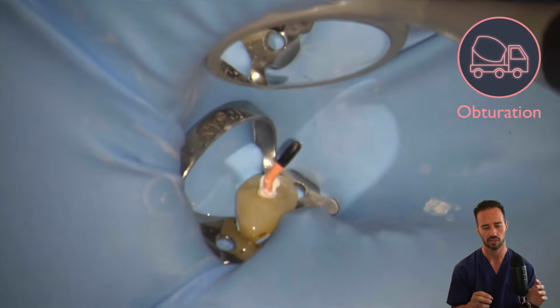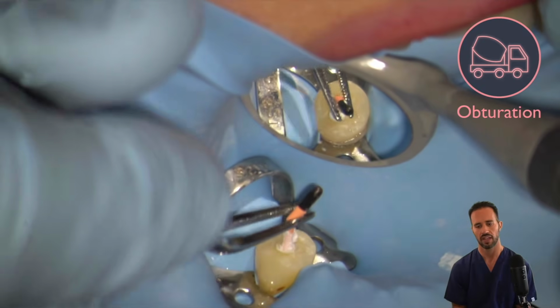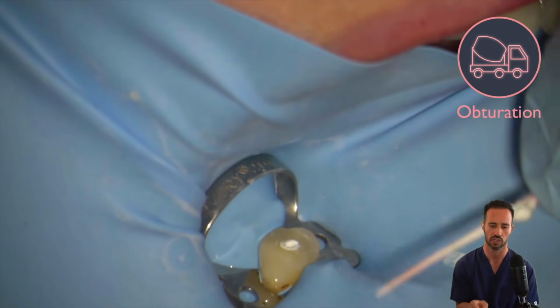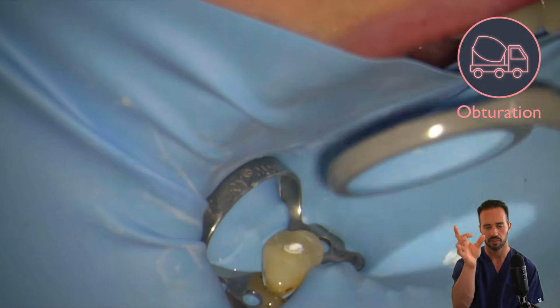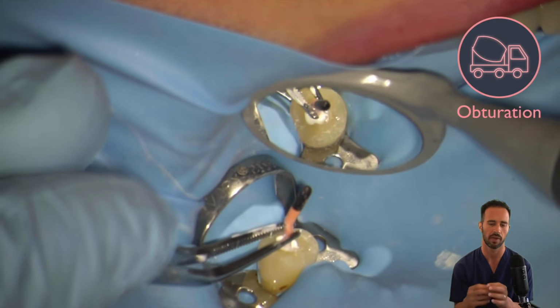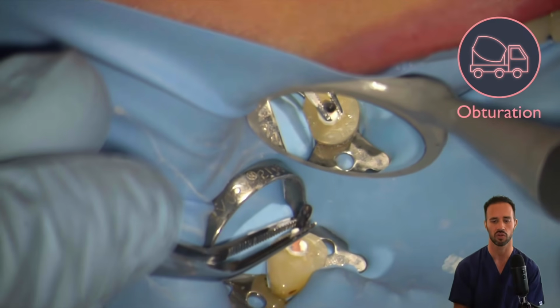So what we're going to do here is remove the gutta percha cone, and you'll just trim back the tip of the gutta percha cone ever so slightly, about 1 millimeter or so. And you want to be careful to not really handle the bulk of the gutta percha cone with your fingers, just in case you have a little bit of saliva or bacteria on your fingers. Remember, we want to treat this like a microbial culture, if you will.